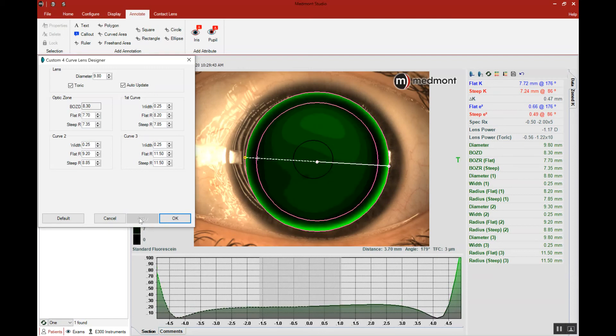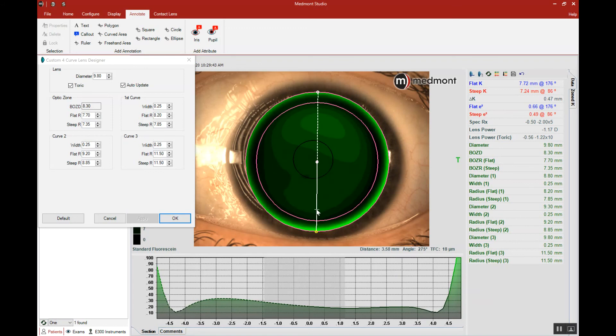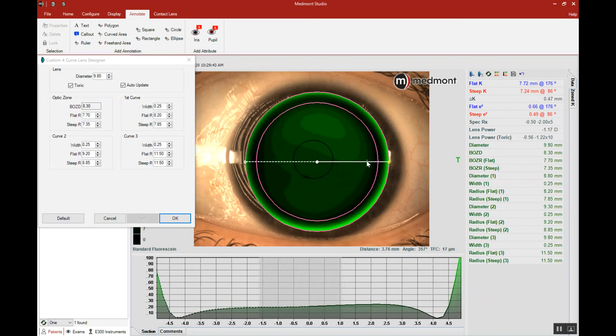When we apply, now the lens is coming close to being in touch with the peripheral corneal surface, and let's see if we have that channel in the vertical meridian. So things are looking pretty good here.